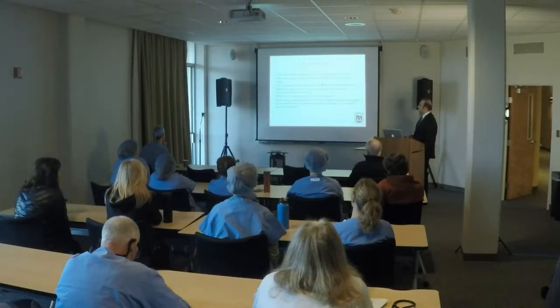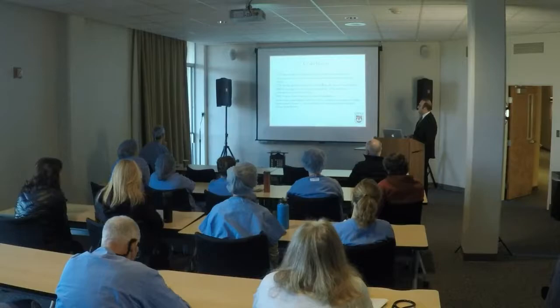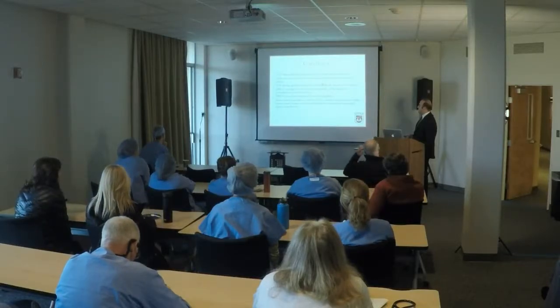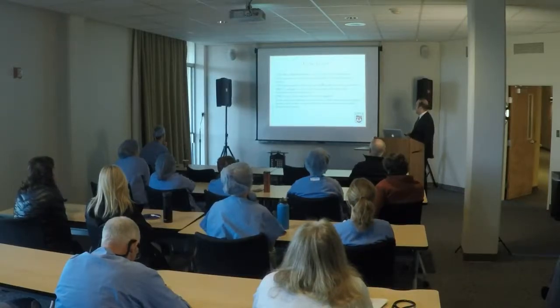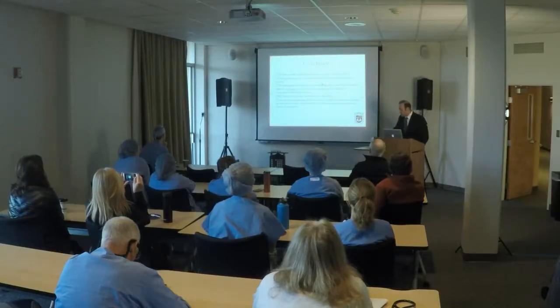And the data from EMERALD is suggesting that these adverse hemodynamic characteristics from CTs are actually better discriminators of culprit lesions that cause acute coronary syndrome than stenosis severity or even adverse plaque characteristics alone.